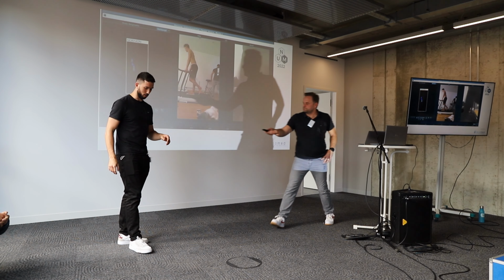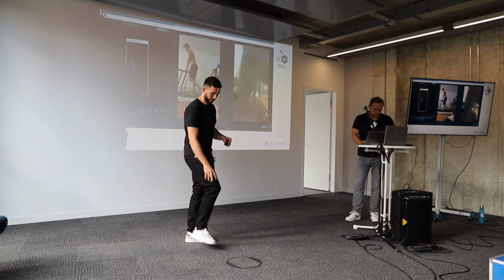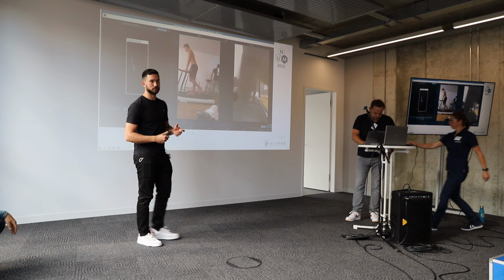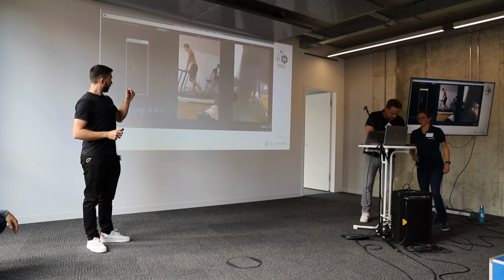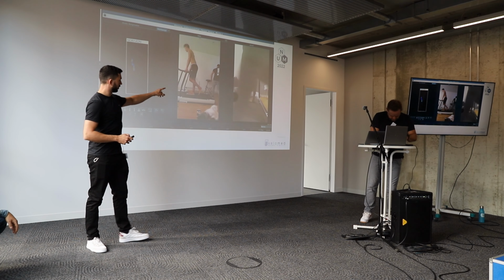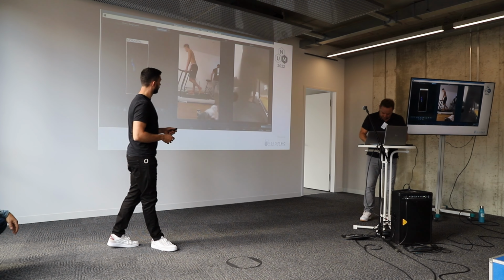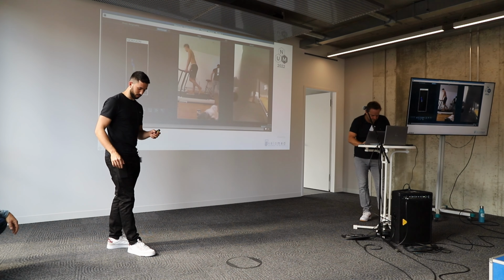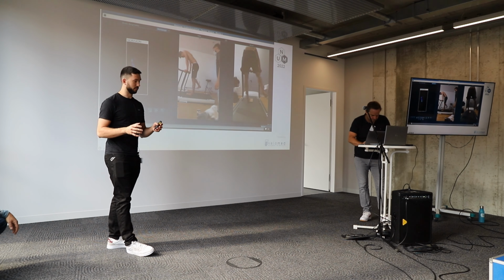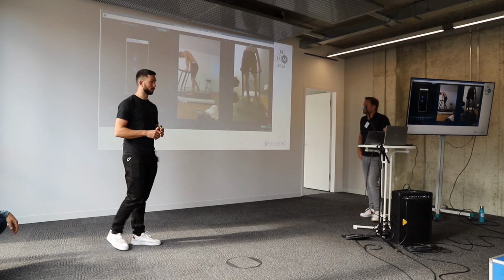So we normally put it like this, that the forefoot part is moving, so we see the motion. We did it like here. You see it later in the video. It's more like bringing the patient into a supination position, and he has the task to put his foot in a flat position.